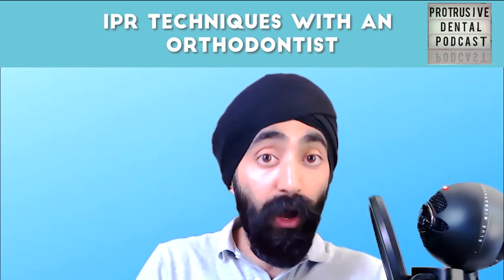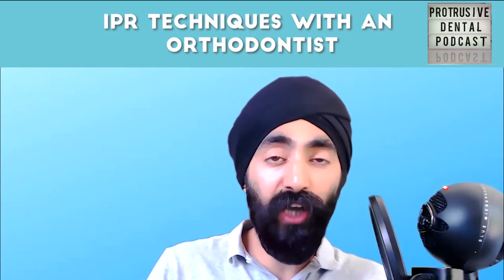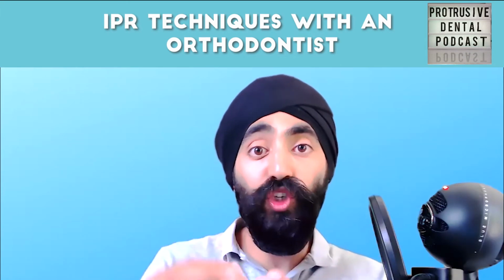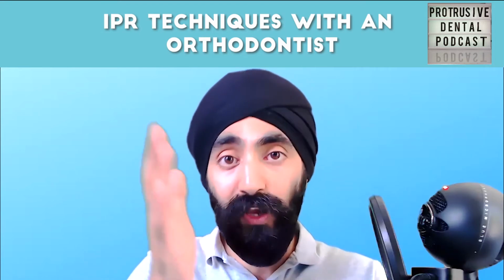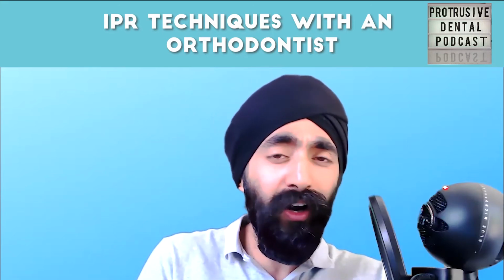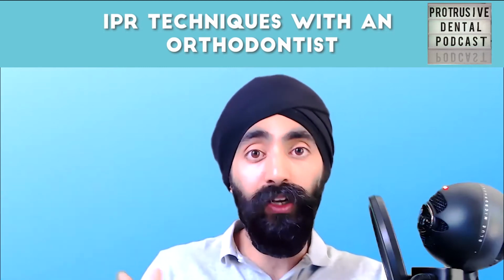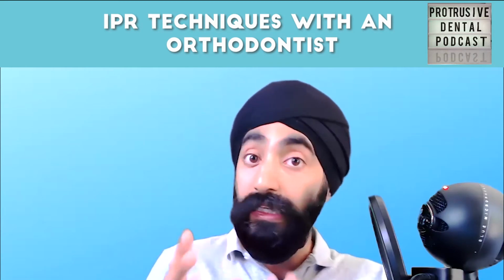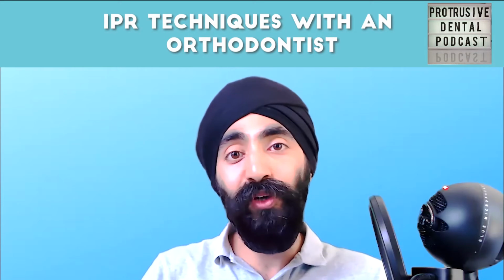So my pearl for you is, if you're doing a clear aligner system with a ClinCheck type of software, the first thing to do when you get your case back from the technician is check the setup. Make sure the teeth are touching correctly as they are in your patient's mouth, because sometimes they do get it wrong, and I've spotted this before. And if they get it wrong, then your whole treatment plan from there will not be accurate. It will be completely arbitrary, because it may align the teeth to some degrees, but it will not match the arches up. So that's my protrusive pearl for you today.